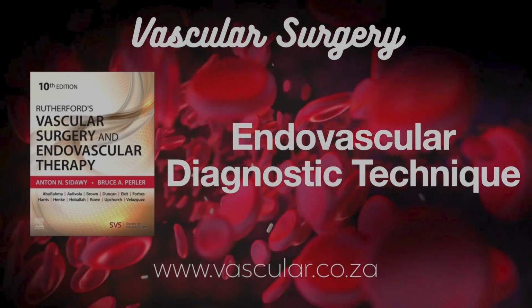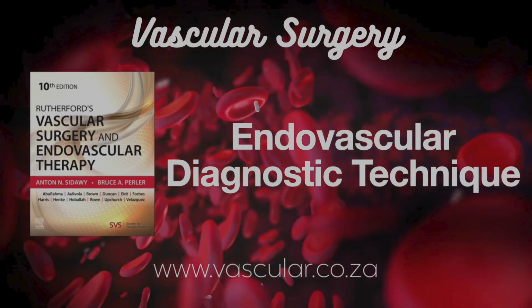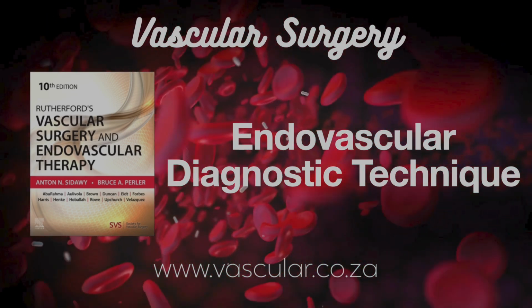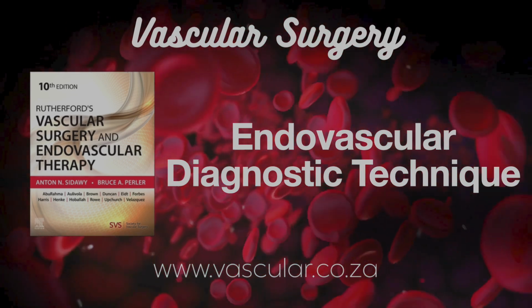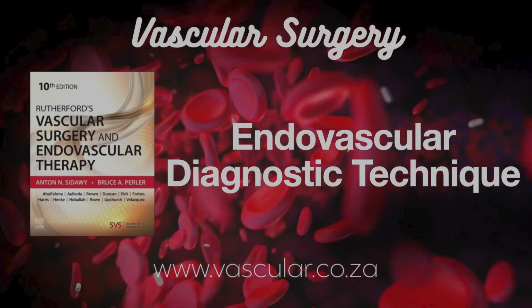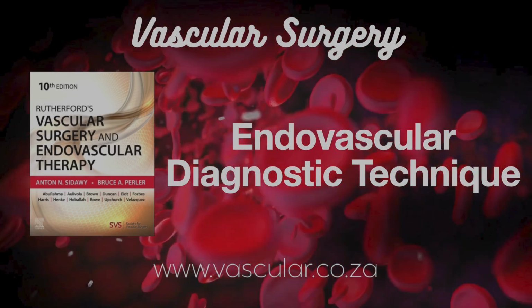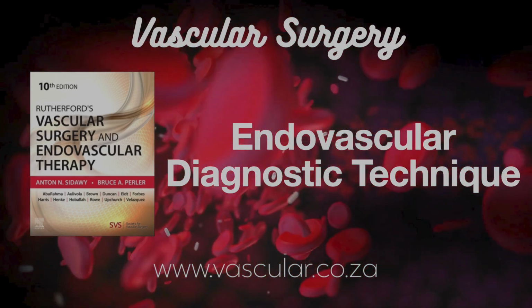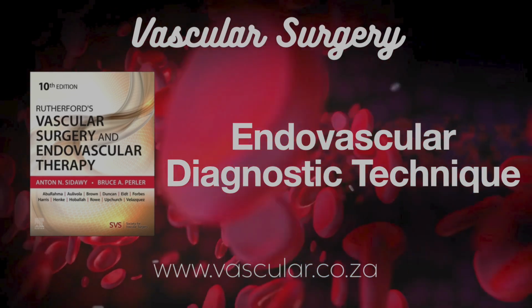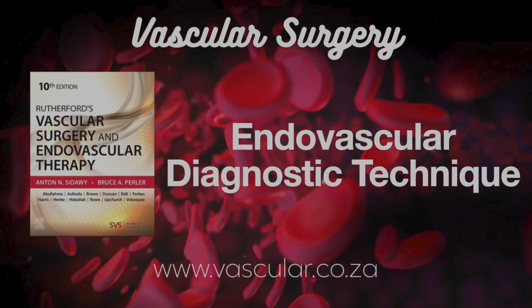Okay, what about going straight into the iliac artery? Seems direct. It does. But percutaneous puncture there is generally a no-no. Big risk. Why is that? Can't compress it manually if it bleeds. And lots of vital stuff nearby. If you need iliac access for large devices, like for aortic repairs, it's usually open surgery. Or sometimes they sew on a conduit, like a little tube, to puncture, or use endoconduits placed from the femoral artery.